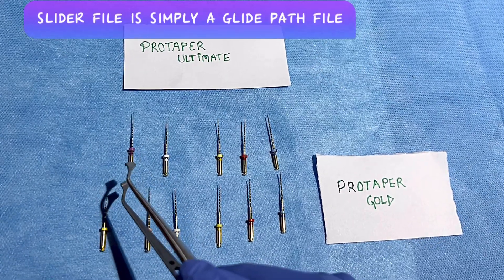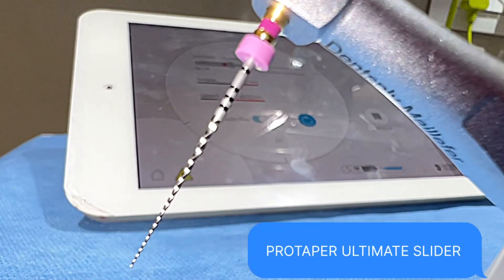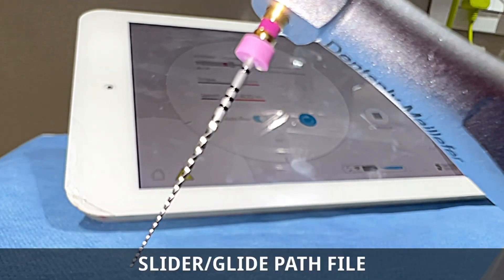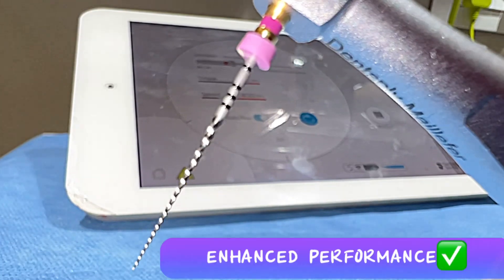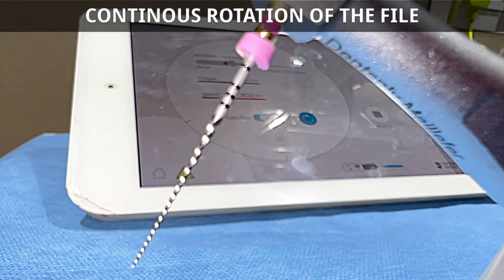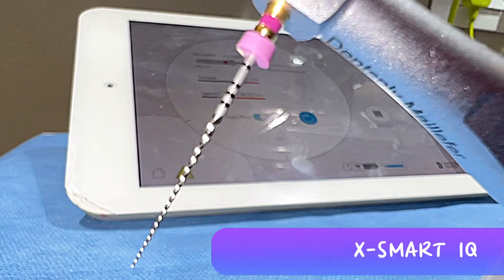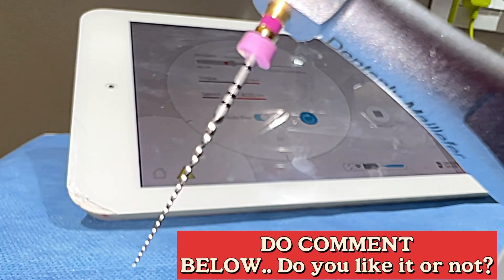This is the Slider, which is nothing but the glide path file. The first file is a purple ring colored file — this is the Slider file in Pro Taper Ultimate Series. As per the literature, it is an M-wire mix of variable parallelogram cross-sections, producing enhanced performance. The alternating offset produces reduced friction and greater space for debris removal. You can see the beautiful continuous rotation of this Slider file, demonstrated here on Xmart IQ by Dentsply with the speed and torque values already fed into my iPad.